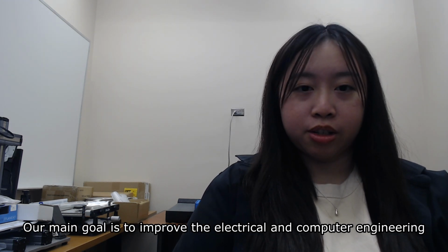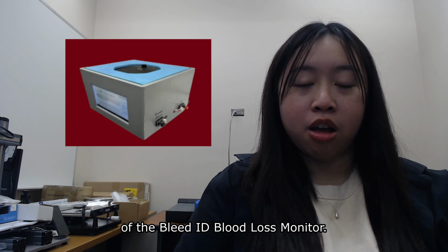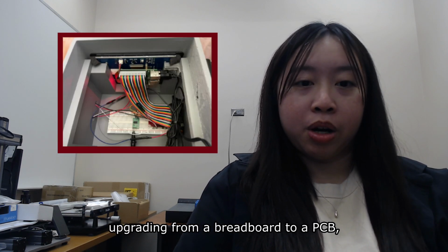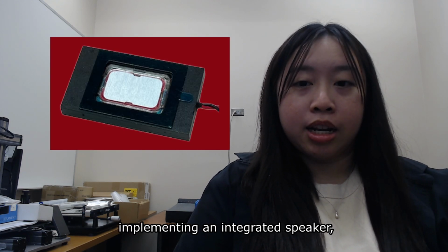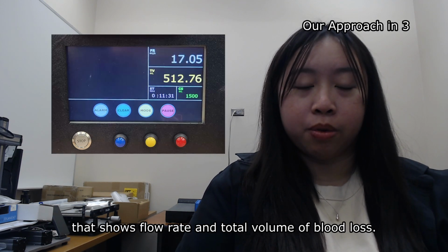Our main goal is to improve the electrical and computer engineering aspects and refine the overall structure of the MAE iteration of the Bleed ID blood loss monitor. This includes, but is not limited to, reducing the overall size of the device, upgrading from a breadboard to a PCB, remedying exposed wires, implementing an integrated speaker, and having an easily interpretable user interface that shows flow rate and total volume of blood loss.